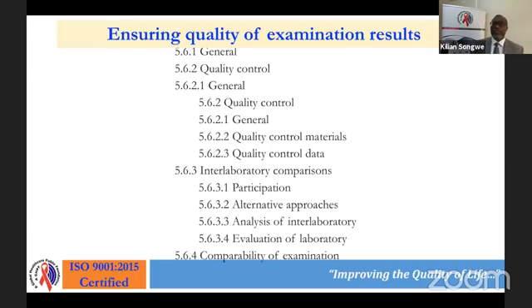So while we're doing quality controls and ensuring the quality of the examination, there is inter-laboratory comparison. We're dealing with a new virus. We're also dealing in a situation where we're using emergency use authorization to run a lot of the tests. So it becomes really important that amongst the labs in any country, if you had a country with 2-3 laboratories that are running COVID-19 tests, every couple of weeks, say for example 6 weeks, they could select a number of samples and share amongst themselves and then run them to ensure that they get the same results. Because in so doing, they will be ensuring the competencies of their laboratories, but most importantly, they will be ensuring that the results that were actually given to the suspects at the different points were actually reliable results, could be repeated, could be tested, and always could be confirmed.